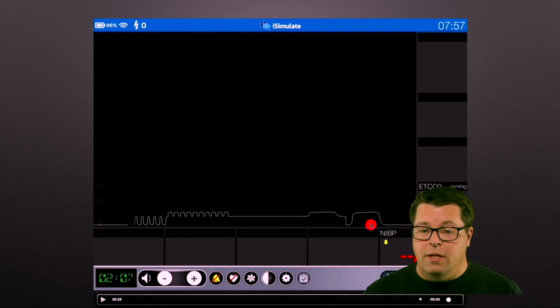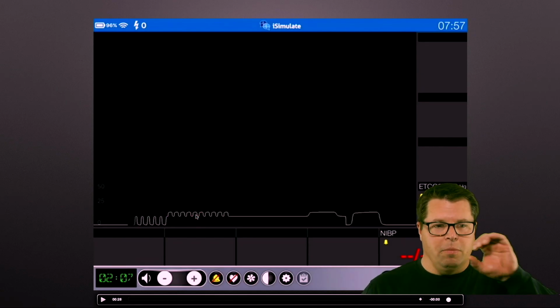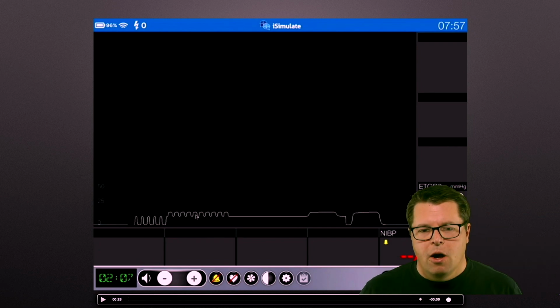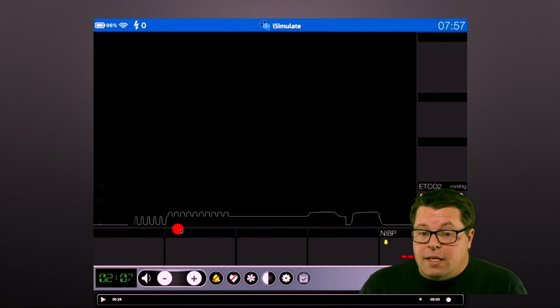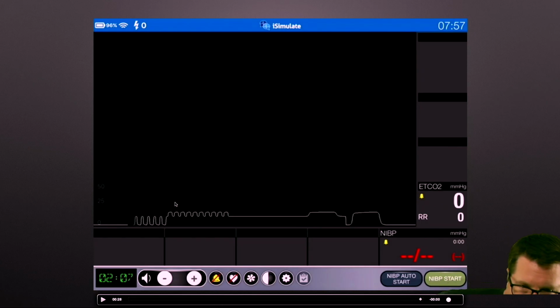It's not doing the stuff that we think it should. It's doing this little other thing that doesn't make any clinical sense, and it doesn't correspond with how we're breathing for the person. And so, yes, this is a CPR waveform. This is a tube that's in the hypopharynx, and little bits of CO2 are getting poof, poof, poof, pushed past it with each one. Yes, this is an end tidal CO2 tracing, but you have to know something about it. It's not enough to just say there's a number and everything's okay.